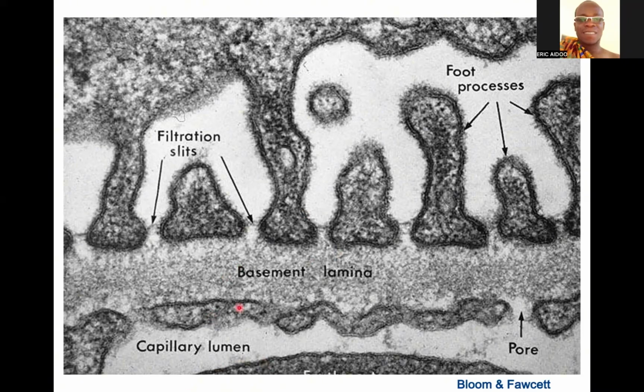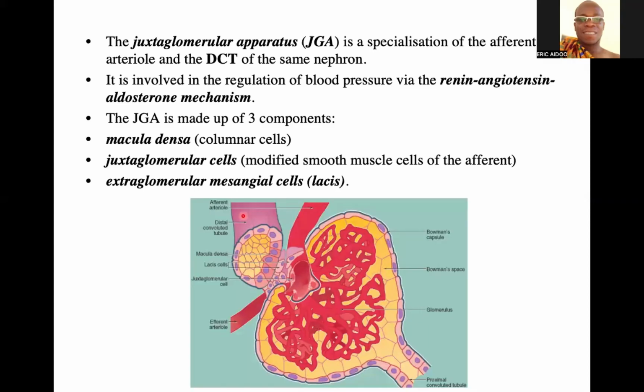So this is an expanded form. That's the basement membrane of the two of them. That's the podocyte and then the endothelium. So this region is that of the endothelium of the capillary. So that will be the endothelial lining. Those are fenestrations. That's why you see a pore there, another pore here. And these are the primary foot processes or pedicels. So that one also has spaces in between them, filtration slits. Okay. So these are some important structures we need to bear in mind.